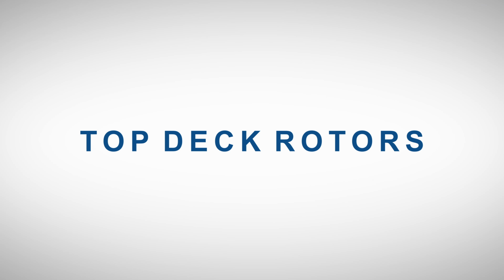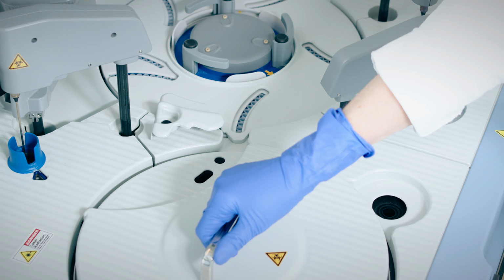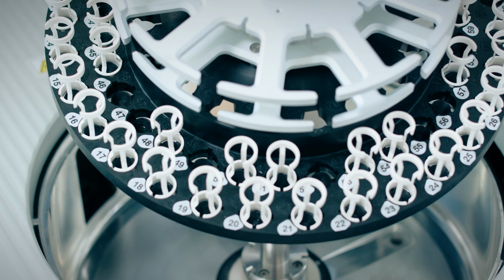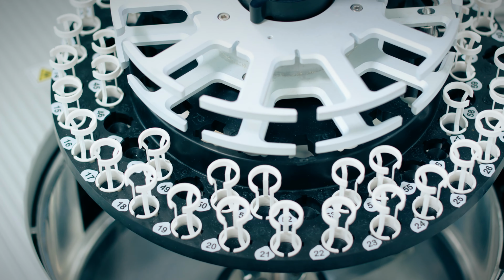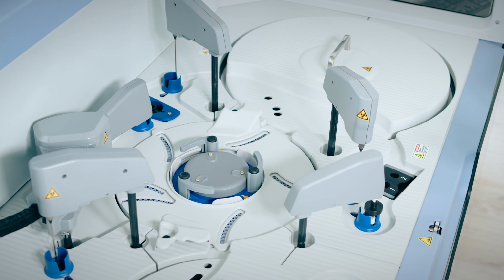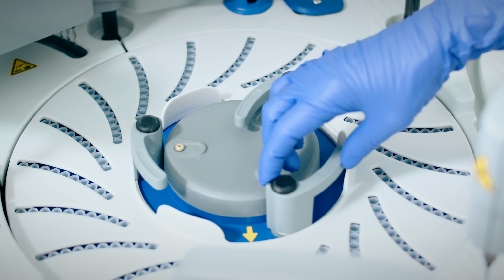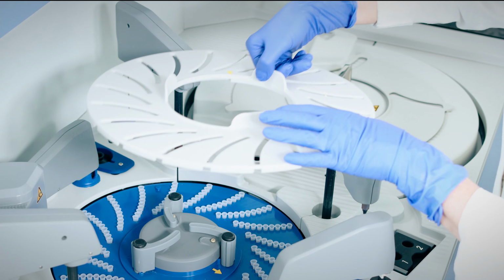Top deck rotors. This is the sample rotor. It is cooled to 5 to 15 degrees Celsius and has a removable carousel which has 60 positions for samples and reagents. In the middle of the top deck is the reaction rotor, which is covered by a splash guard plate, as well as by a cuvette hold-down plate.